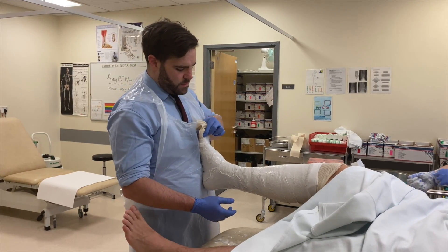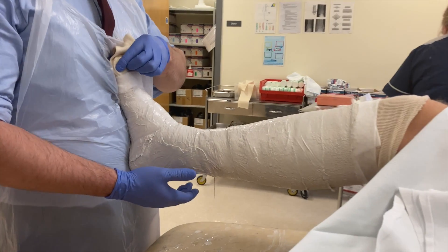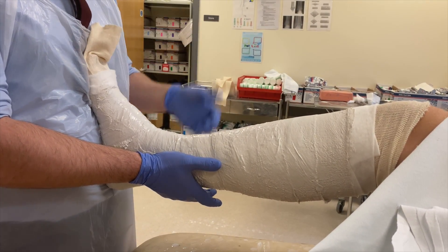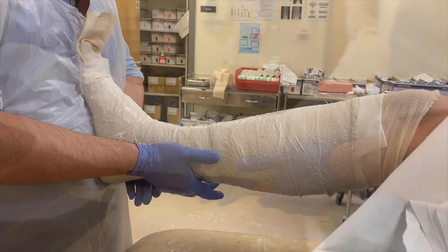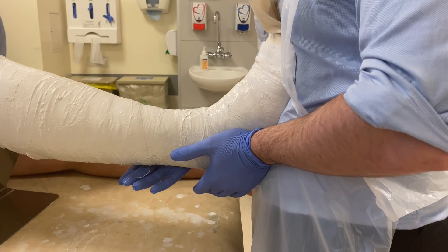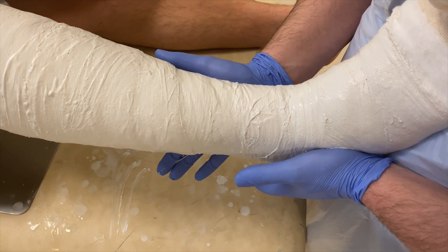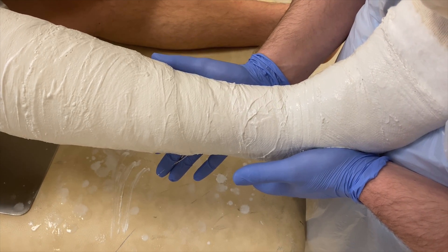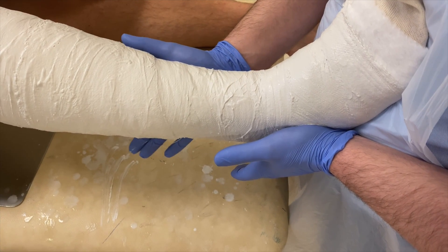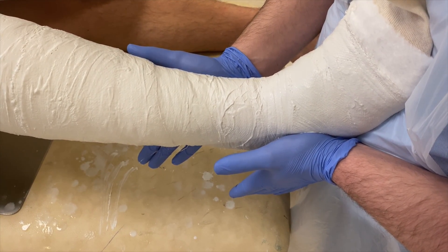The next bit is all about molding. What I'm going to do is one hand here on the medial tibia, one hand here on the lateral calcaneus, pressing like this, encouraging the ankle to come up into a good position. Then I'm just gently pressing both sides to reduce the talar shift and the ankle fracture.